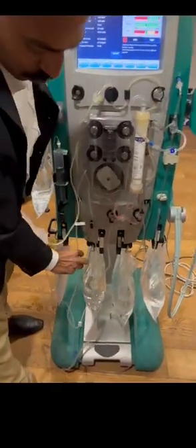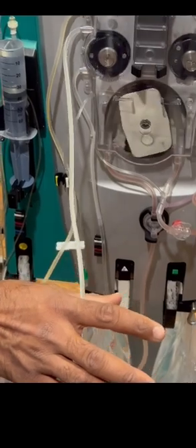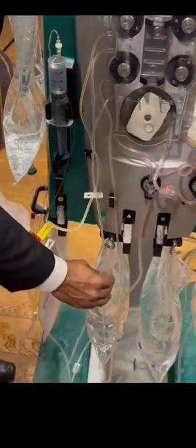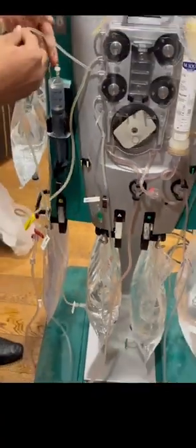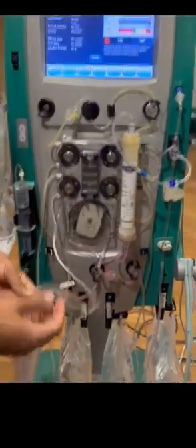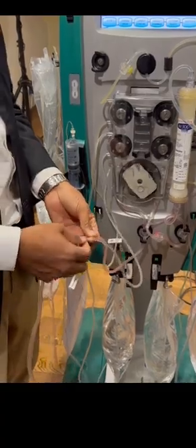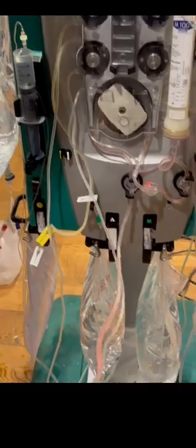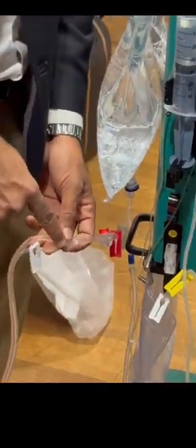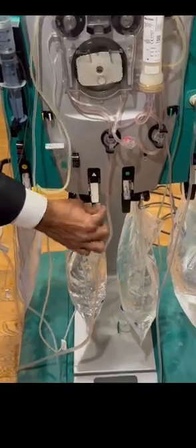Okay. Now this line is the effluent. No, the white one is the pre-replacement citrate line. So here we had Regiocit, that is the citrate solution. This is coming to this pump. From this pump, this comes out. It is just stuck with this, not directly connected. Then this comes to the access end. So this is the pre-replacement as well as a citrate line. If our anticoagulation is citrate, that will work as an anticoagulant line. Otherwise it is a pre-replacement. Also it will work as a dilutant. If it is heparin-free and you are increasing this one, the blood becomes diluted and comes to the filter. So this line, this scale, this line and this pump are over.